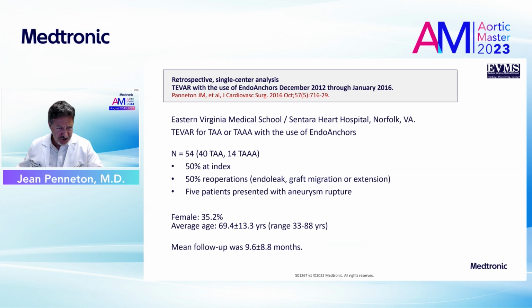We did publish our experience with using EndoAnchors in TEVAR. And this was on 54 patients. 40 of those patients had thoracic aneurysm, 14 had thoracoabdominal aneurysm, so they did have to have fenestration into their visceral branches.